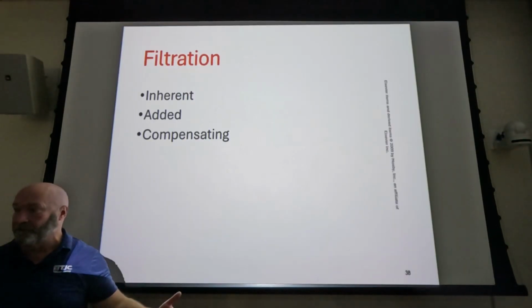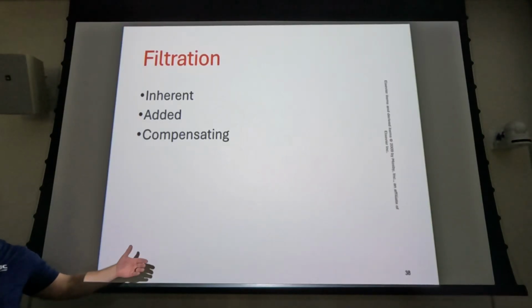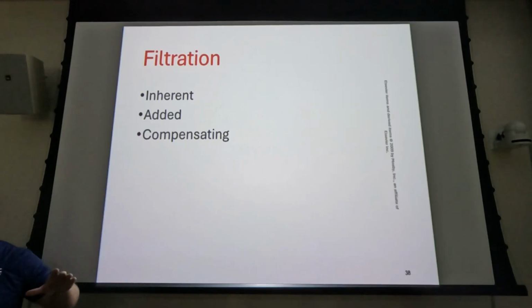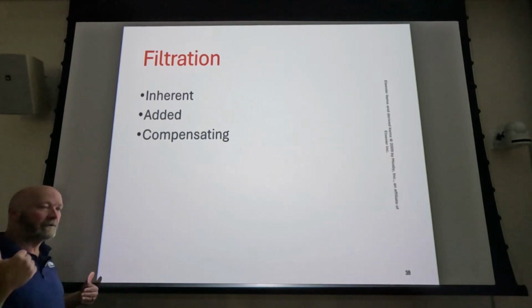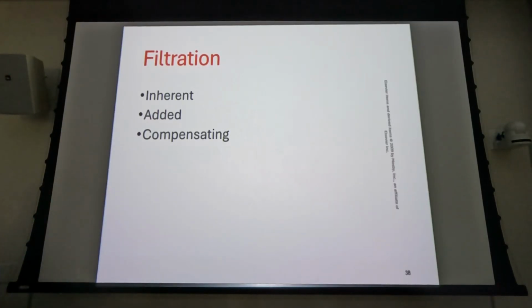You can shoot through the collimators. I mean, collimators aren't as efficient as what we think they are. You can have an exposure that goes straight through those collimators. But anyway, we'll collimate in and then put the trough filter on, double wedge, and we'll shoot the patient PA in order to minimize that breast dose. So you might still see compensating filters there, but we used to have them to even out tissue density differences, and those are your key words: even out tissue density differences. Those are compensating filters, or trough filters to minimize breast dose in scoliosis series.